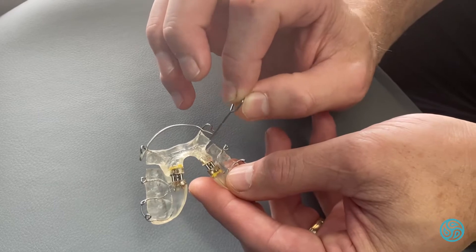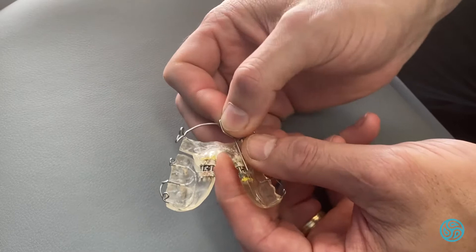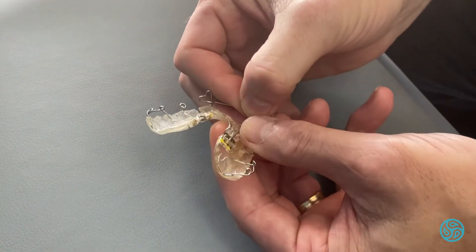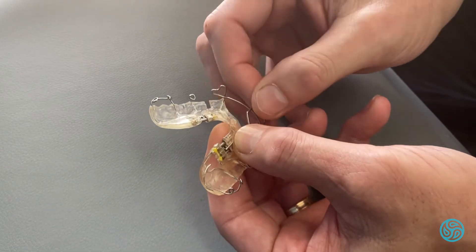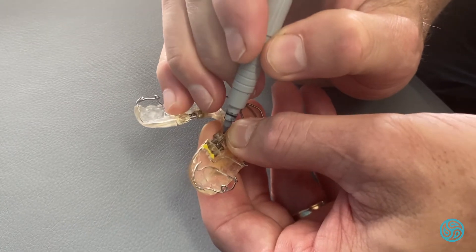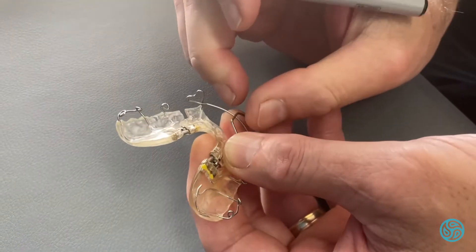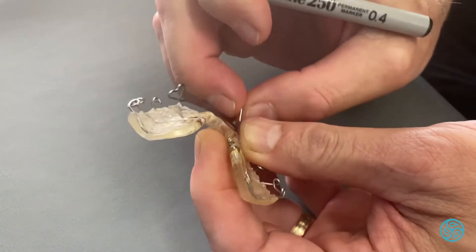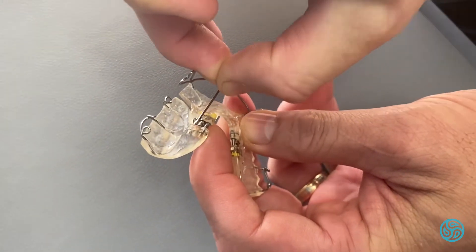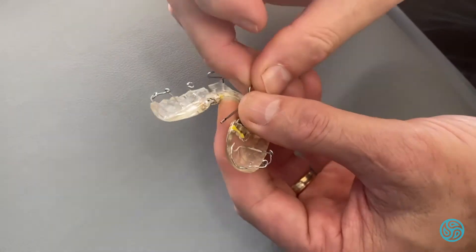What I'd advise to make sure that happens is to use the little key and put it across the little gap there, then use a permanent marker and mark where that is. Look at the other side and see if it is equal, and then we can make sure that it continues to go forward.